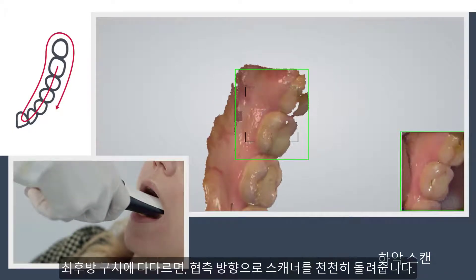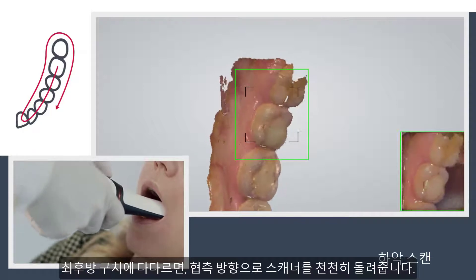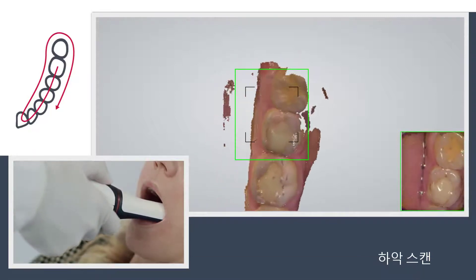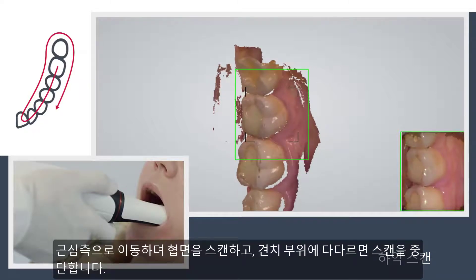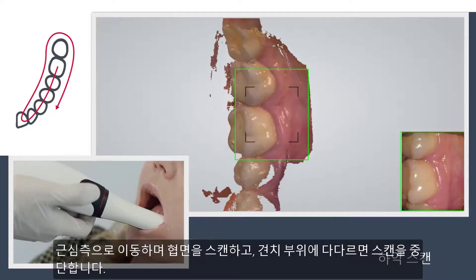Slowly roll over at the last molar going towards the buccal side. Scan the buccal side by moving mesial and stop the scanning when the K9 has been scanned.